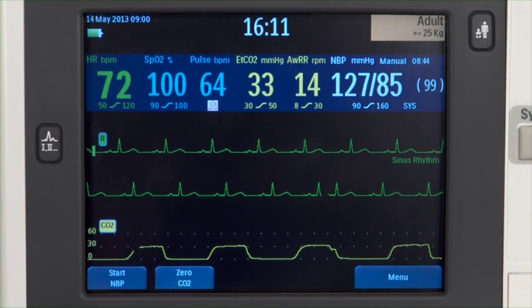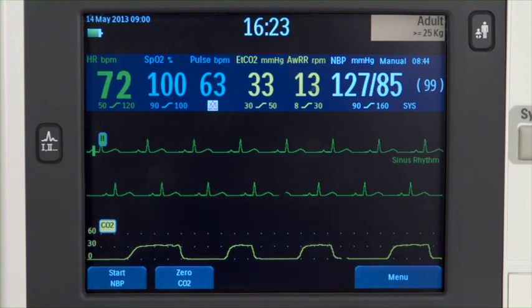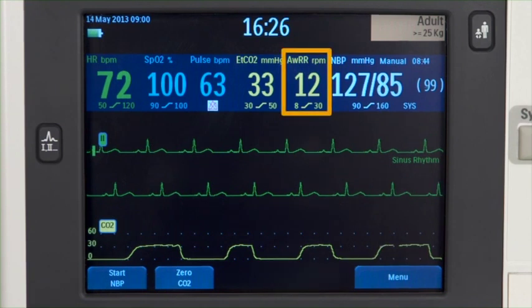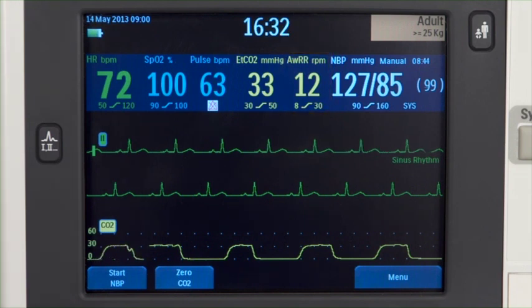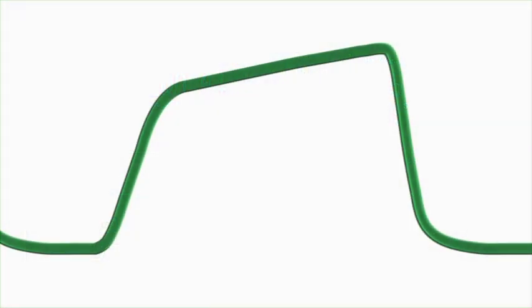There are two measurement values associated with CO2 monitoring. The first is ETCO2, or end tidal carbon dioxide, which is the peak CO2 value measured during expiration. The second is AWRR, airway respiration rate, or the number of breaths per minute. In addition to the values, the monitor displays the CO2 waveform or capnogram in the configured wave sector, if available. It is important to note that on a capnogram, positive deflections represent expiration, whereas negative deflections represent inspiration, which is the opposite of most respiratory waveforms.